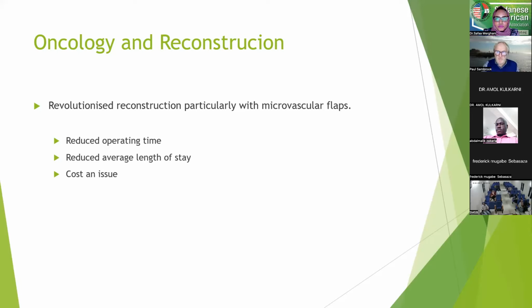And I get asked by my hospital, we do have data on this, what are the advantages of using patient-specific implants and virtual surgical planning in terms of oncology and reconstruction? There is no doubt that there is a reduced operating time. There is no doubt that there is a reduced average length of stay as a result of that reduced operating time and reduced morbidity in terms of the oncologic resection and oncologic reconstruction.